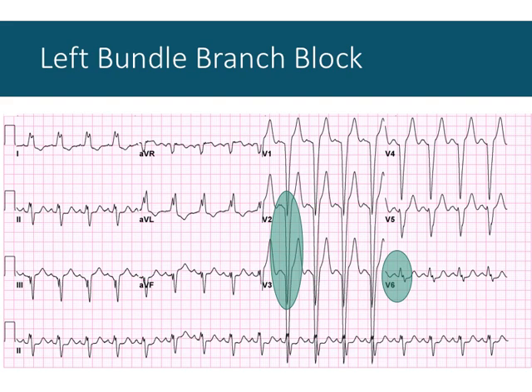It's also possible to see this if you place the electrodes incorrectly. So if you see this in lab, don't necessarily freak out. It might be a good reason to go consult your physician or see a cardiologist if you're worried, but it could just be that you placed the electrodes incorrectly.